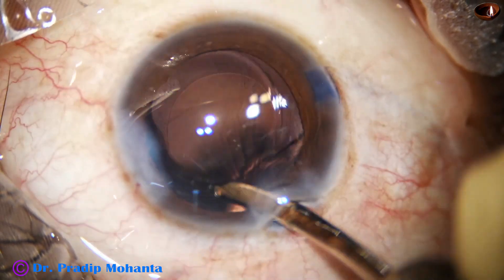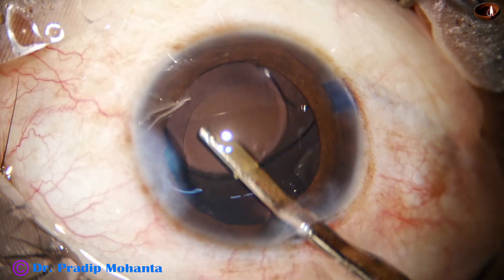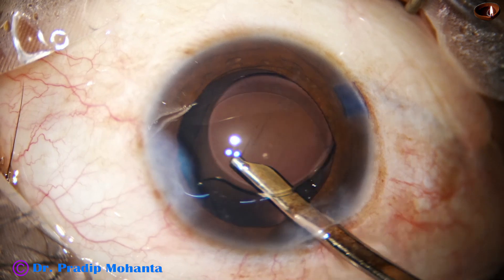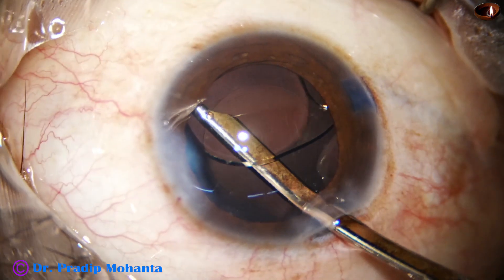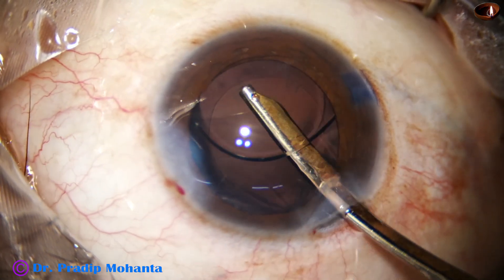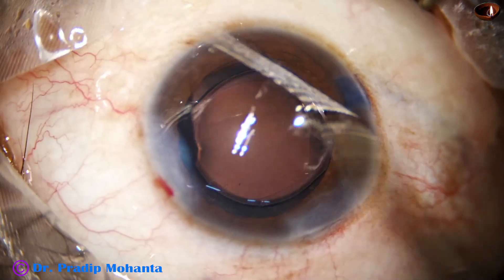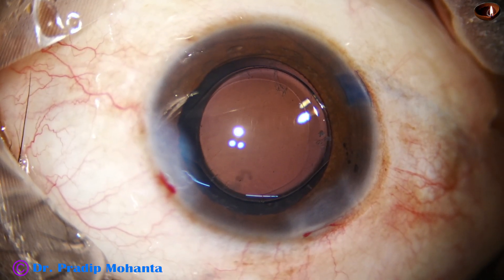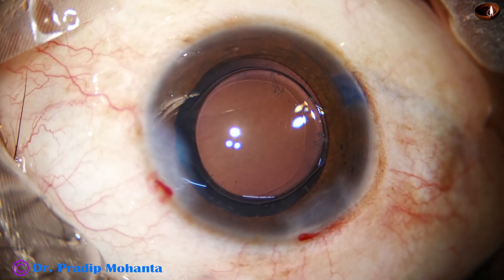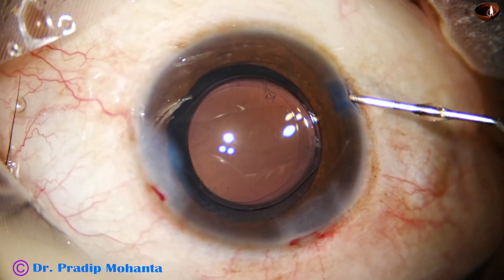If the wounds are of adequate size, we don't have to hydrate a lot — minimal hydration will cause sealing of the wounds. If the wounds are very small, they will get stressed and there will be fish-mouthing of the wounds, causing them to leak a lot. To close those fish-mouth wounds, we have to hydrate a lot. I have seen fellows hydrating almost the superior one-third of the cornea to get the wound sealed.